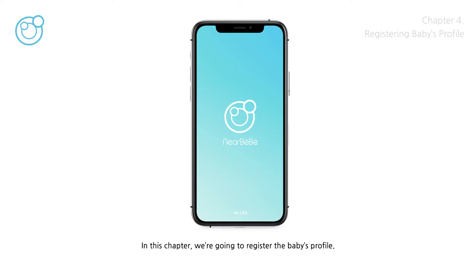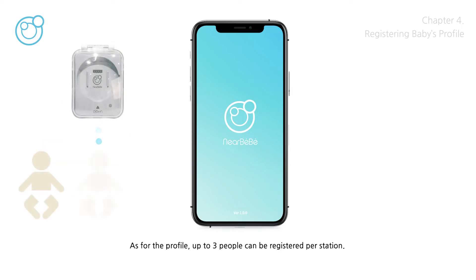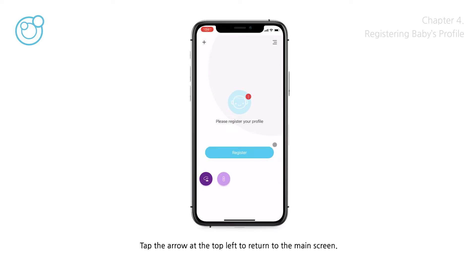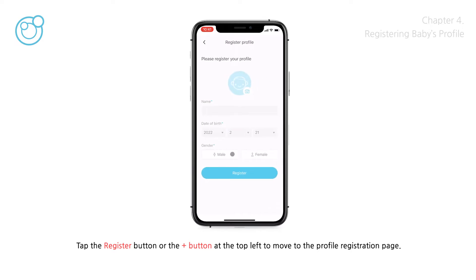In this chapter, we're going to register the baby's profile. Once the baby's profile is registered, the data measured by care is automatically saved per profile. Up to three people can be registered per station. Tap the arrow at the top left to return to the main screen, then tap the Register button or the plus button at the top left to move to the profile registration page.